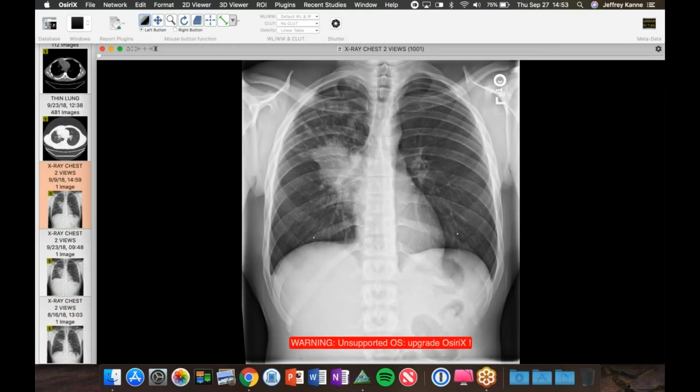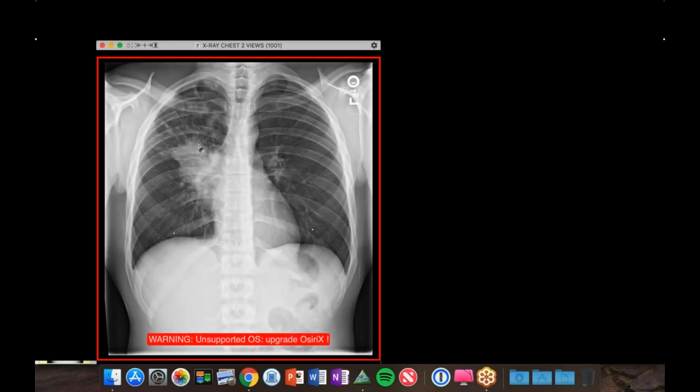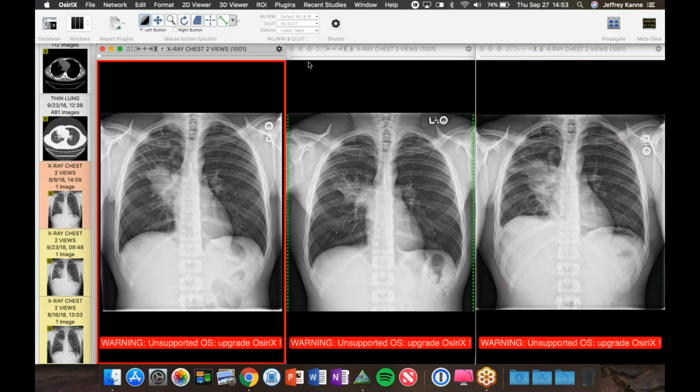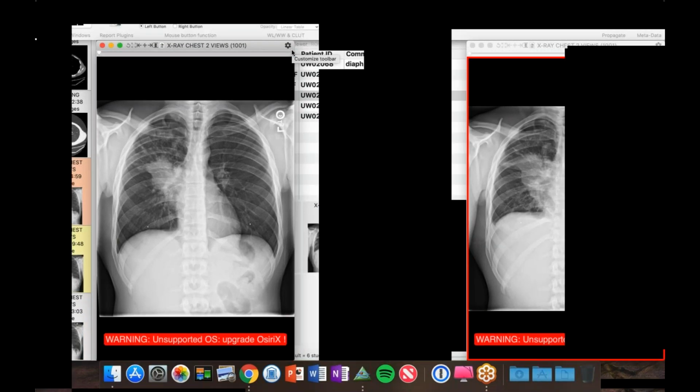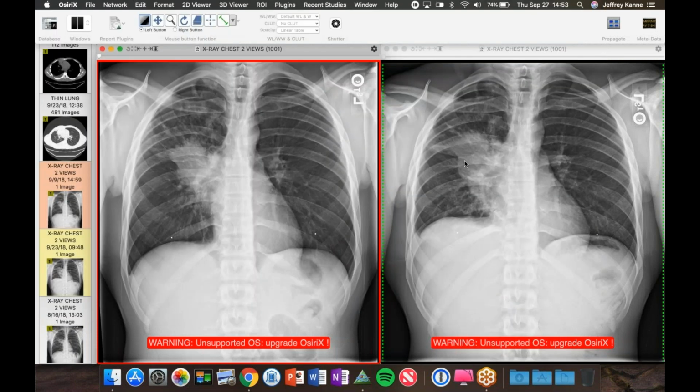Presented about 2.5 to 3 weeks later with worsening symptoms. I should put these up side by side so you can see that there has been a progression. The mass-like area is larger, and there are more nodules on the periphery of this. We don't see any lymphadenopathy on the radiograph. We don't see pleural effusion. And then subsequently was given another round of antibiotics and presented again, and I'll just take away this one. You can see continuing to get worse. So a rapidly growing mass in the right lung.